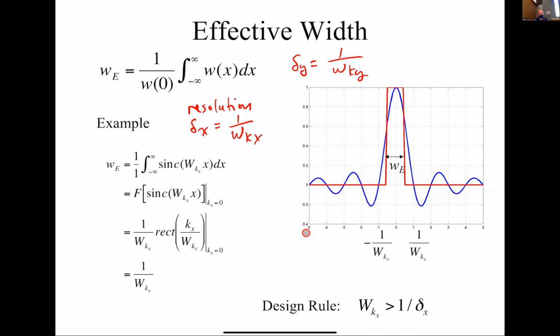So where this comes in is, say your technician or your doctor says, I want to acquire an image with some resolution, like a millimeter, a centimeter. You're like, fine, your MATLAB code or whatever code you have would just say, okay, from that, if I know delta x, I can always solve for wkx, right? So that's one of the other simple design equations that you'll have in your MATLAB code.